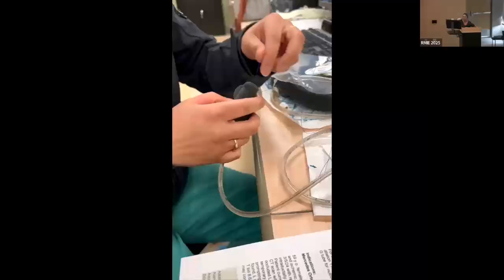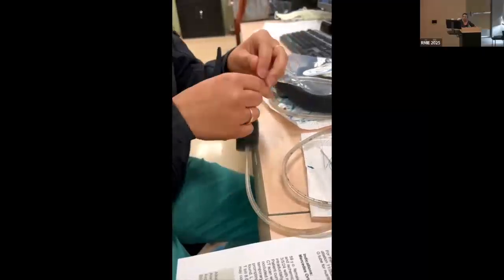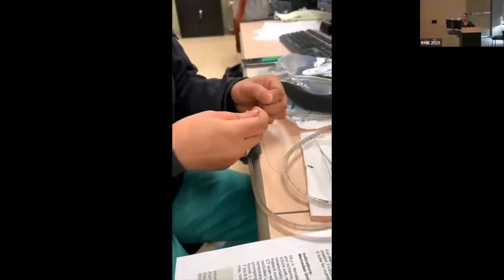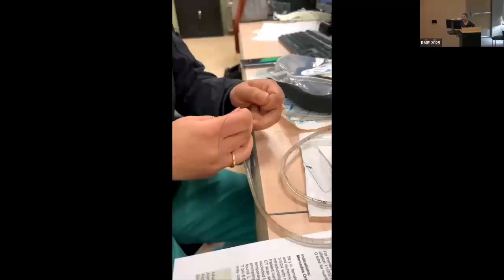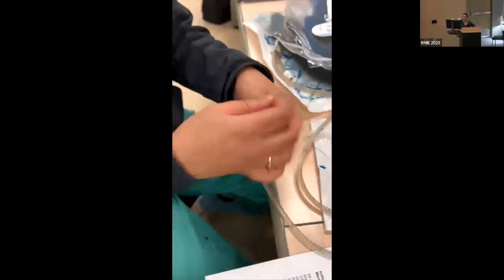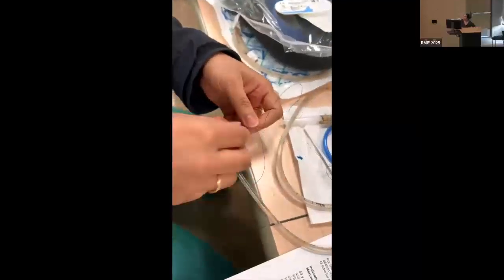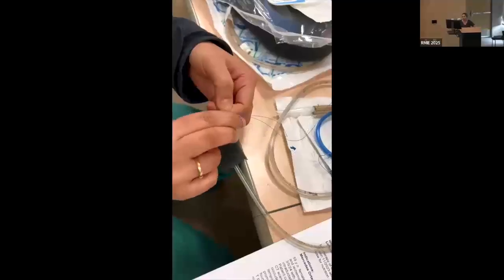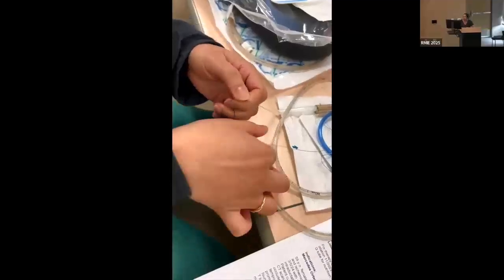then you suture in your sponge to the tube. We typically do suture at the tip as well as on the more proximal end of the sponge. And then we create 2 loops with that suture. The goal of that loop is that you have something to grasp with when you are advancing it through the oral cavity and into the esophagus and into the stomach.